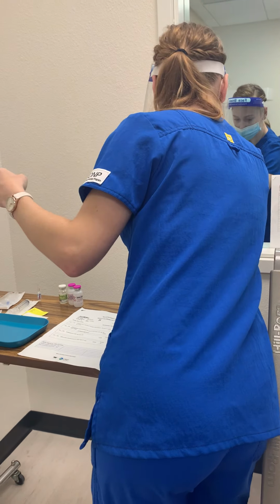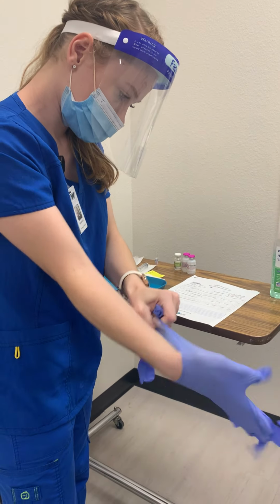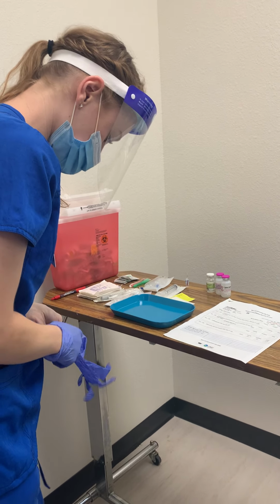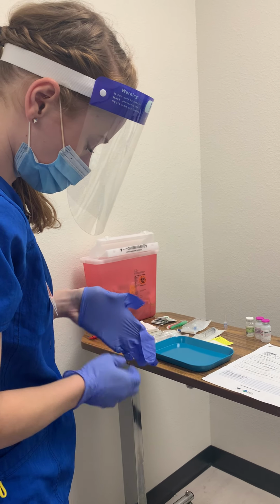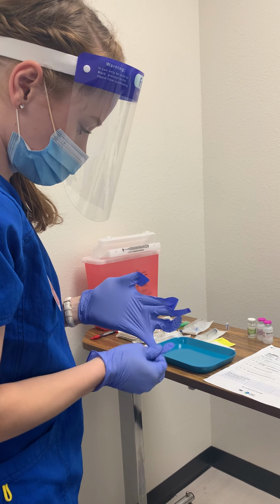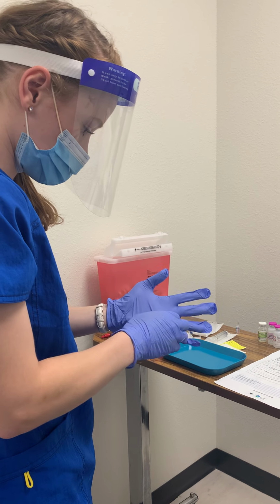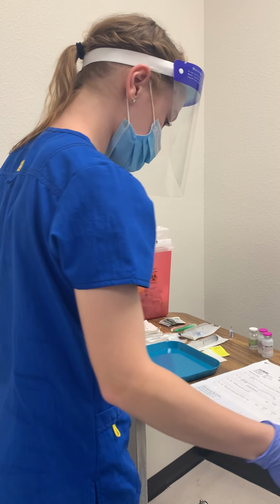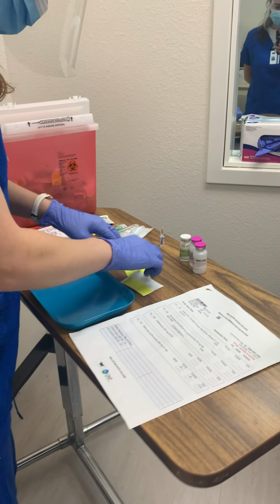Make sure that dries. And then I'm gonna grab my gloves. I'm still in my med room. There we go, they're nice and on. Okay, perfect. So for this, I'm gonna be checking my meds.